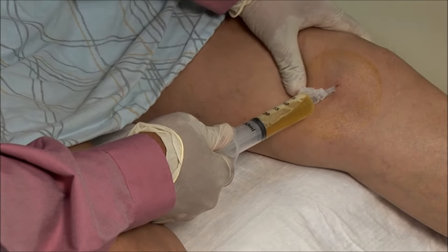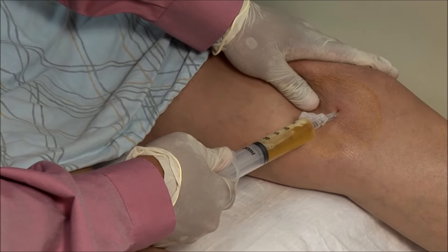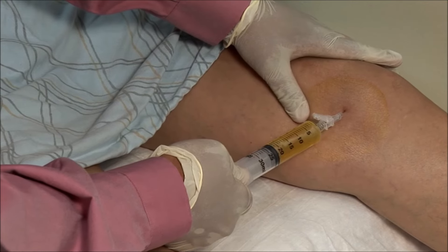I am massaging the knee a bit to see if I can get any additional fluid. I got just about 22 mils.